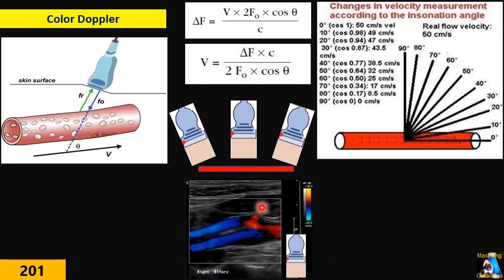For fixing this problem, because we don't have much maneuverability in the neck, which is a very tough and rigid region, and we don't want to push too much because it can narrow the vessel, they put in an option we call the steering box.